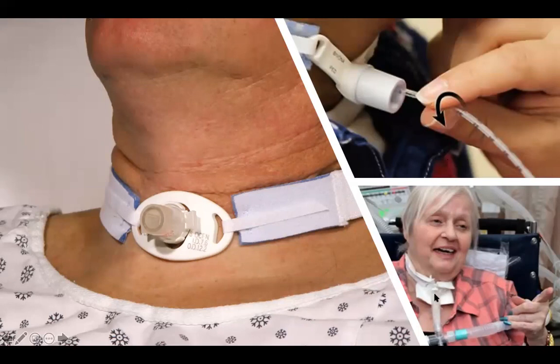This picture is of a trach hooked into a ventilator, and you will see a lot of tubes coming out of the ventilator and hooked into that trach. And this little green thing over here is a speaking valve.